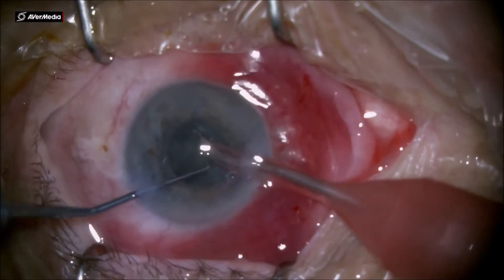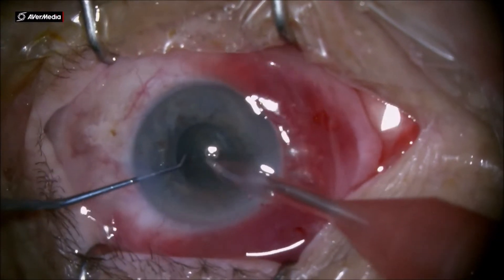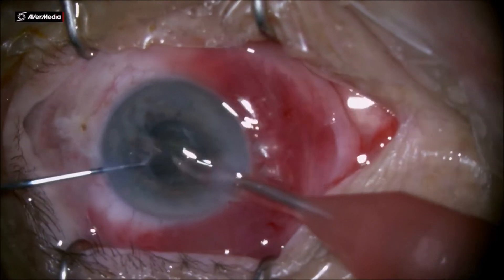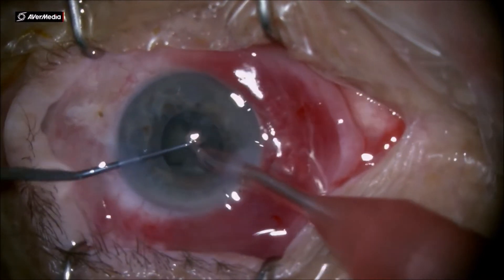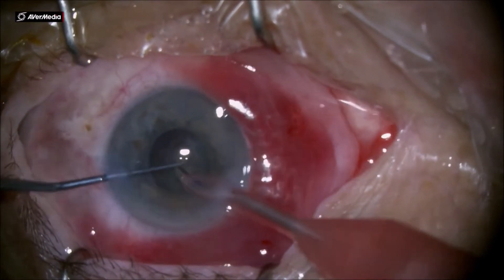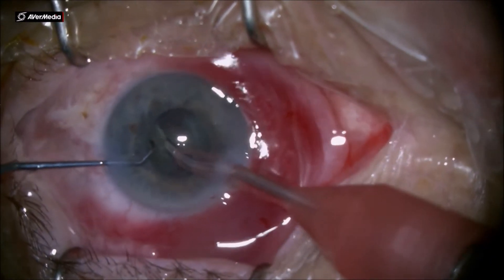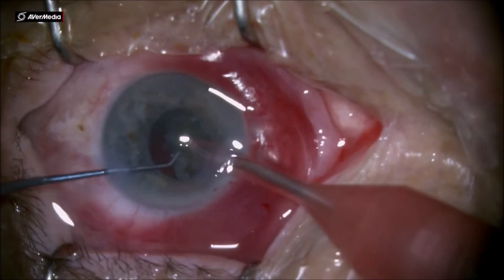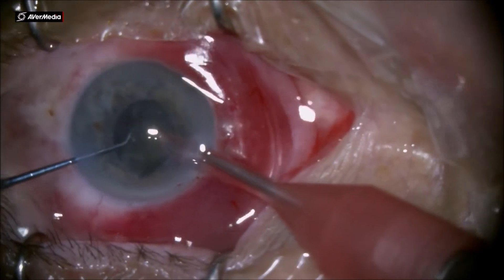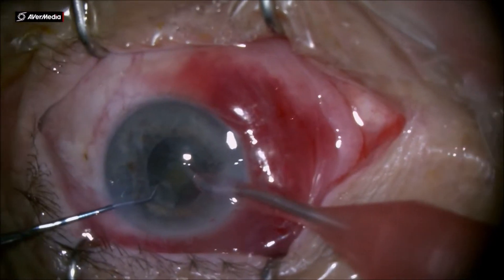Notice the fact that you always need to stay in the middle of the pupil with the phacoemulsification and you really don't need to hurry in these cases, since you barely have space in the anterior chamber to move the instruments. The entire phacoemulsification needs to be inside the bag. Therefore the bevel is here sideways and the foot pedal is very carefully pressed for short bursts of emulsification.